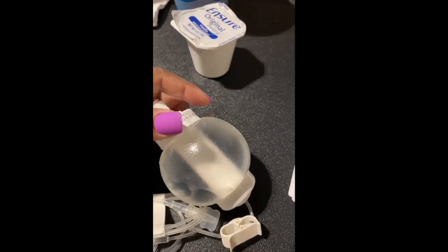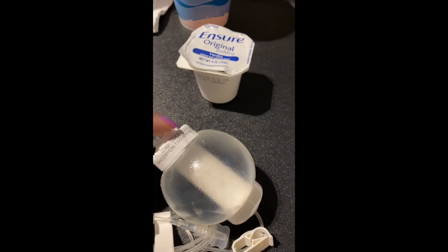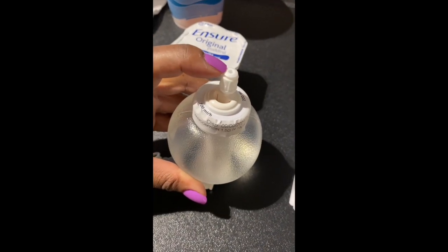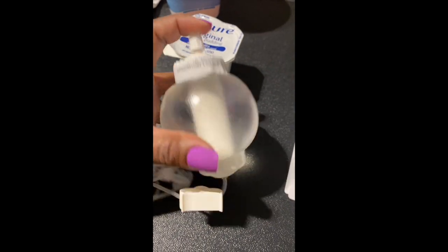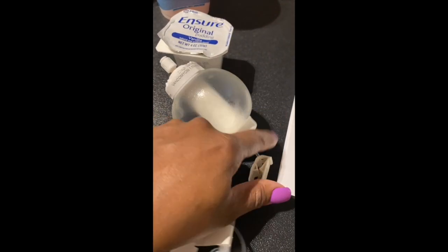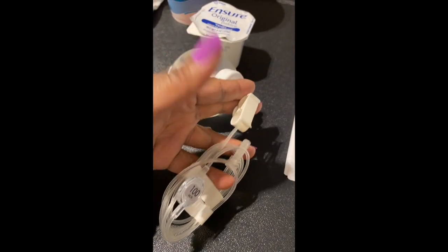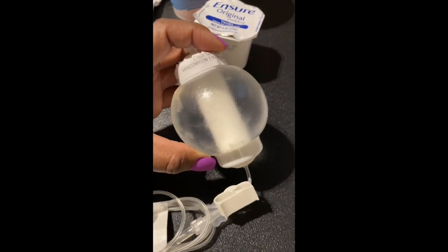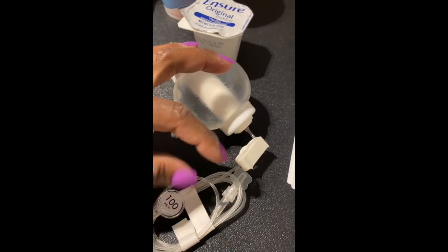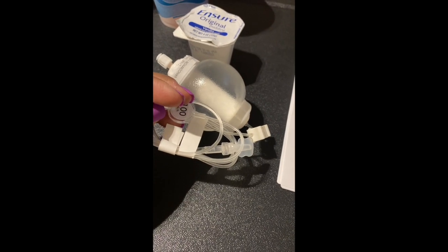I've never seen this either — so innovative, right? This part right here, you don't do anything to it, you just leave that on and let it sit. It's really super easy. When you hook it up, you want to prime it — undo this part, undo that, prime it, let it drip out. You don't even hook it up to a pump or anything at all. You don't need a pump, you don't need nothing. It's already set at 100 milliliters per hour with the dosage and drip rate it needs.